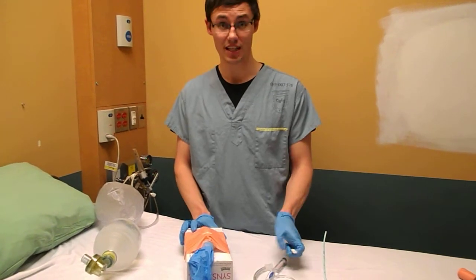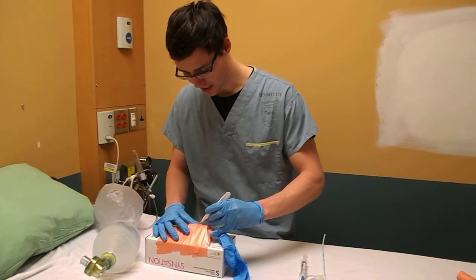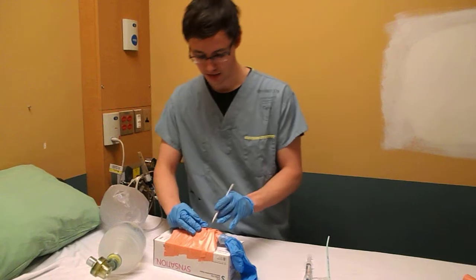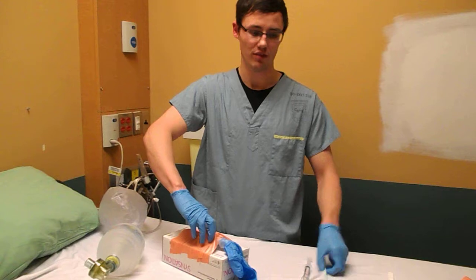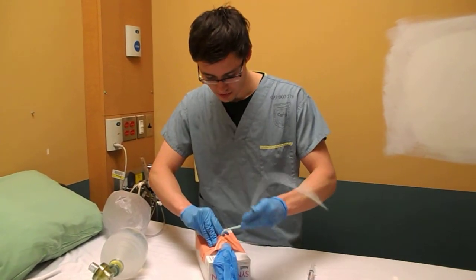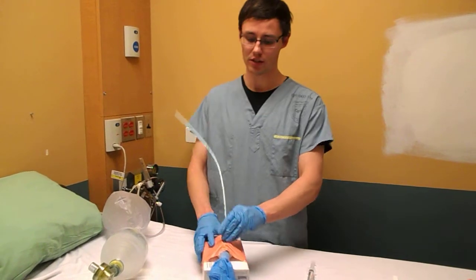So this is the quintessential slash trach. First thing: scalpel, cut the skin — long cut on the skin. Next, spreading. Cut through the cricothyroid membrane. Finger in, finger stays in. Grab your bougie, get your bougie in, slide it along the tracheal rings.